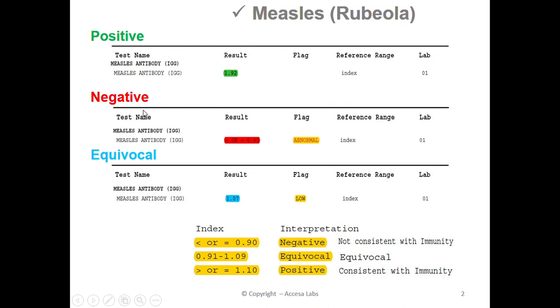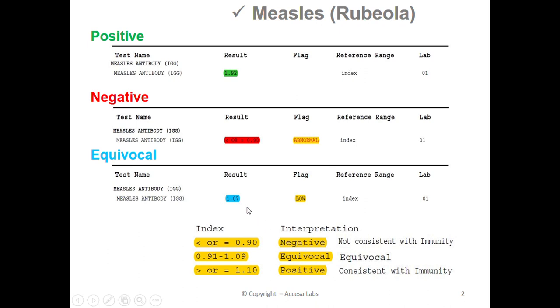Next we'll look at a negative result. Once again, we will look under the result header for our numerical value. This sample report has a result of less than or equal to 0.90. You may also notice an abnormal notation under the flag header. Based on the Quest Diagnostics Result Index shown here, any result less than or equal to 0.90 is negative, which implies that a person with this result does not have immunity to the measles virus. Therefore, this represents a negative result.